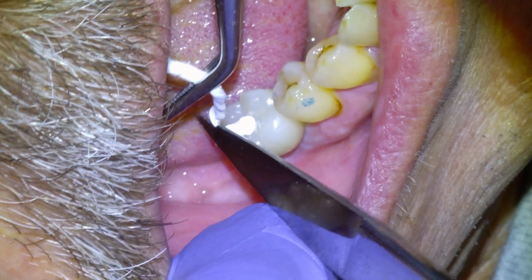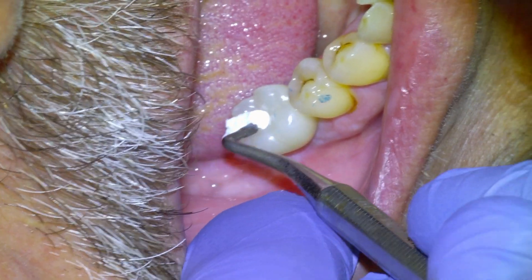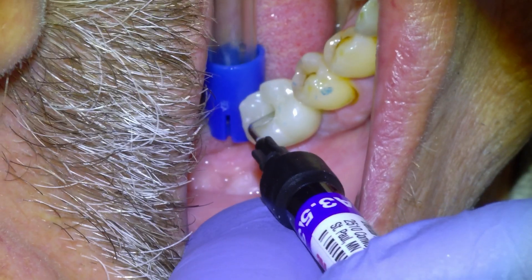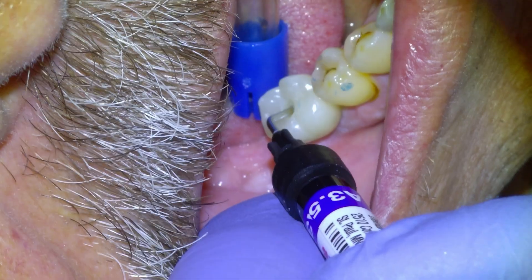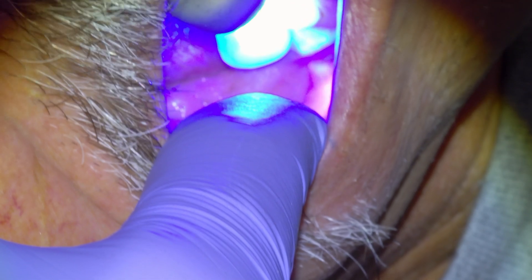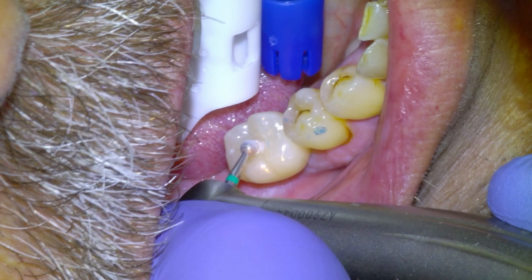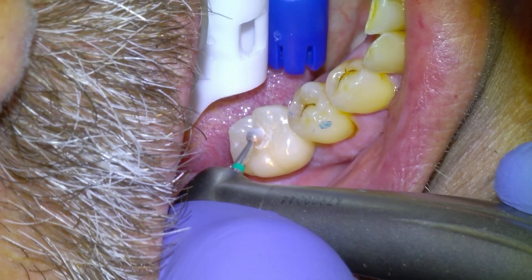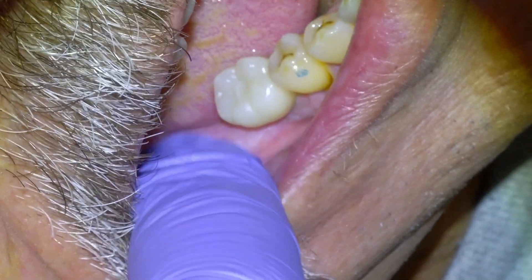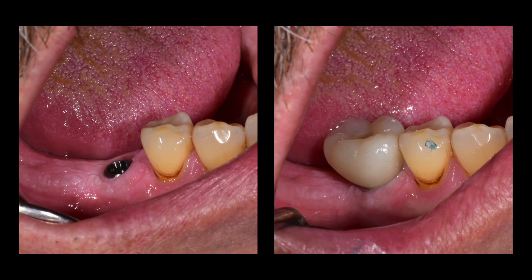I always re-torque, especially single units, after anywhere from two to six weeks of service. It's a good idea to re-torque because if the interproximal contacts are tight and it loosens a bit, the crown can come loose, the parts get scratched, and it becomes more likely to recur in the future. I shave off the excess flowable composite and we'll have them back in a couple of weeks. There's an x-ray of the finished product and an intraoral photo.